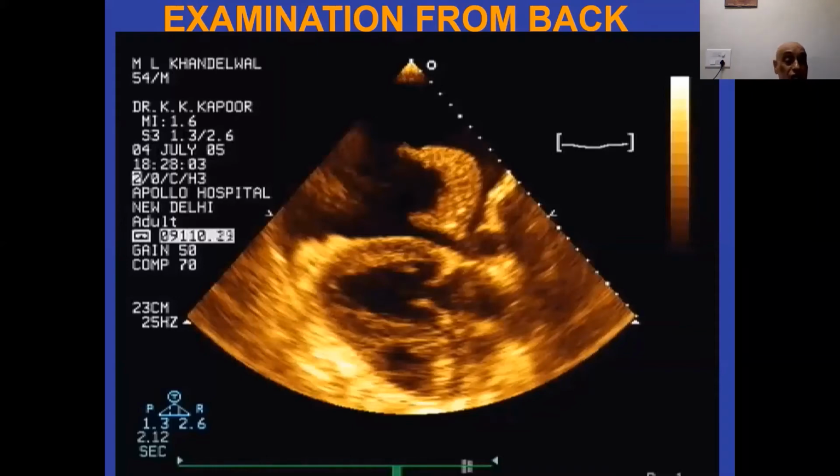You make the patient sit up and put the transducer in the right suprascapular, right midscapular, left midscapular, or left infrascapular regions to look for any pleural effusion. If there's a pleural effusion, you can visualize the heart through it. You see first the left ventricle and then the right ventricle.